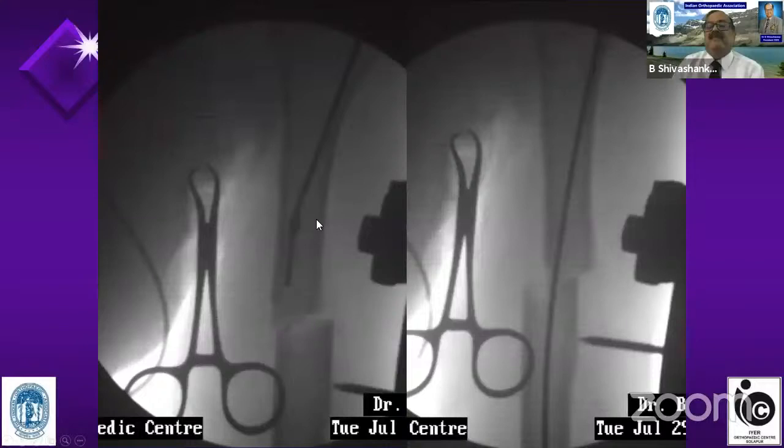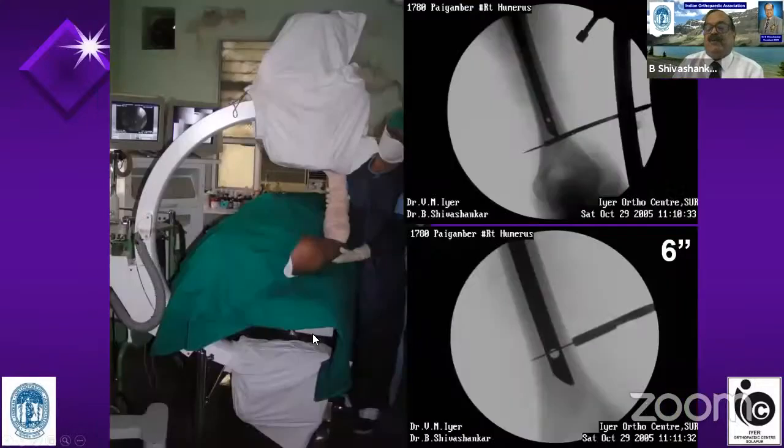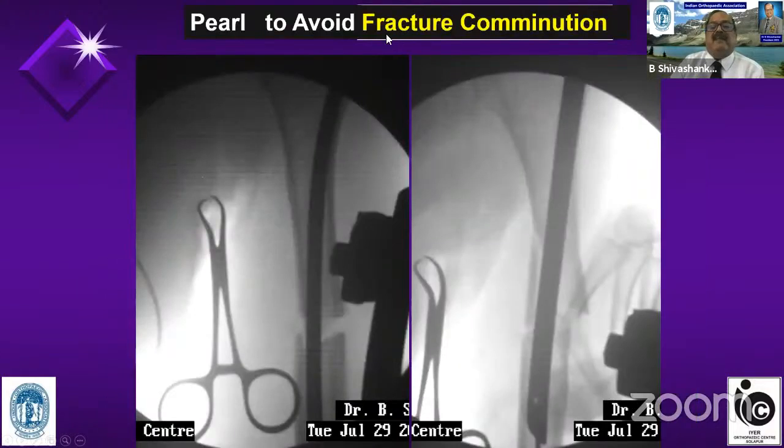What had happened, since it was eccentrically placed, the flexible guide wire could bend and go into the distal fragment. The flexible guide wire has gone and it has reamed. But when I pass the nail, you can see there is an iatrogenic comminution. So that is the reason why I'm insisting that your guide wire should be central both in AP and lateral. Even if you want to take the entry from the top, from the articular surface, especially in proximal humeral fractures, don't worry. Go and take an entry from the top in line with the center.